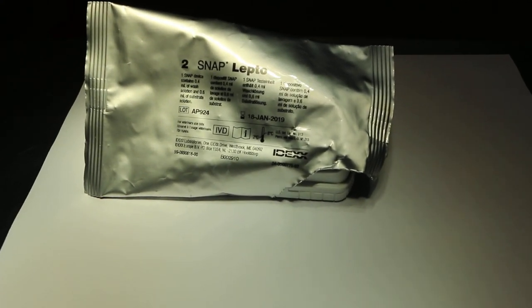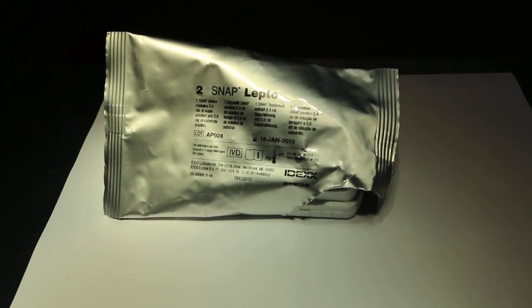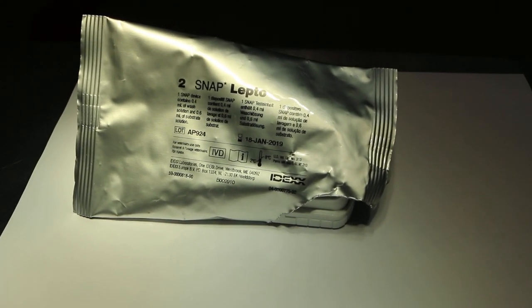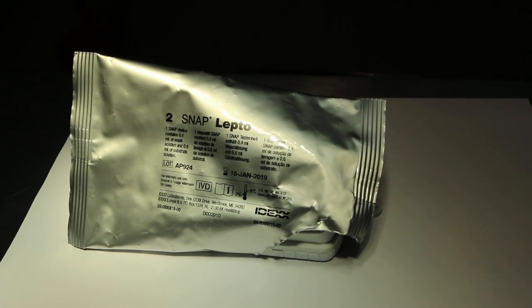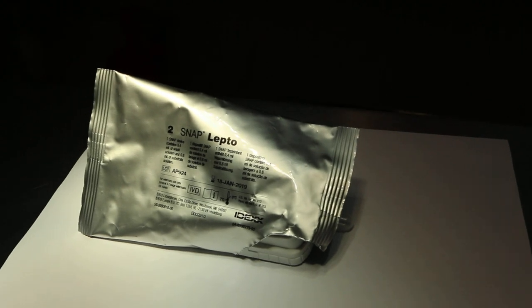12th of December 2018, Wednesday. This is a veterinary educational video to show how we do an IDEXX SNAP lepto test. We start at the beginning where the blood is collected. All components must be at room temperature before running the test.